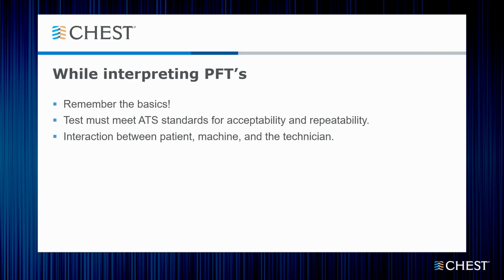And for the test to be good, it has to have a good interaction from the patient, the technician who's doing it, and you need to have the appropriate machine too. So make sure all these three are effective so that we can interpret our PFTs.